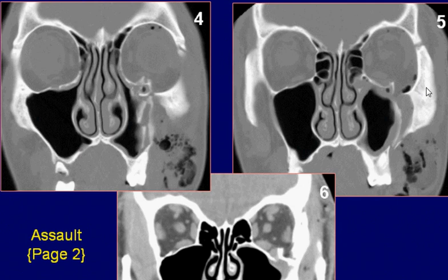Coronal CT scan of the face in soft tissue window settings shows deformity of the floor of the left orbit with associated soft tissue swelling.